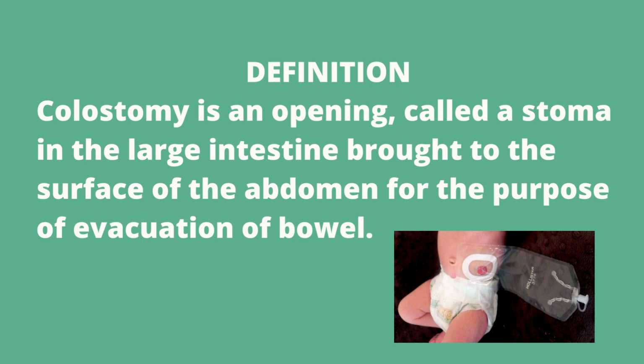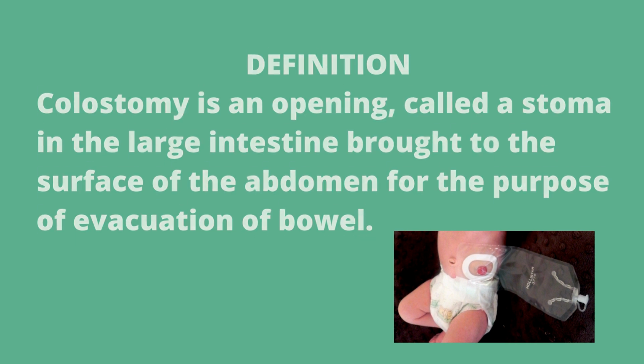So colostomy means there is an opening over the large intestine brought to the surface of the abdomen. For which purpose? For the purpose of evacuation of bowel, meaning evacuation of fecal matter. Okay, so that is the definition of colostomy.